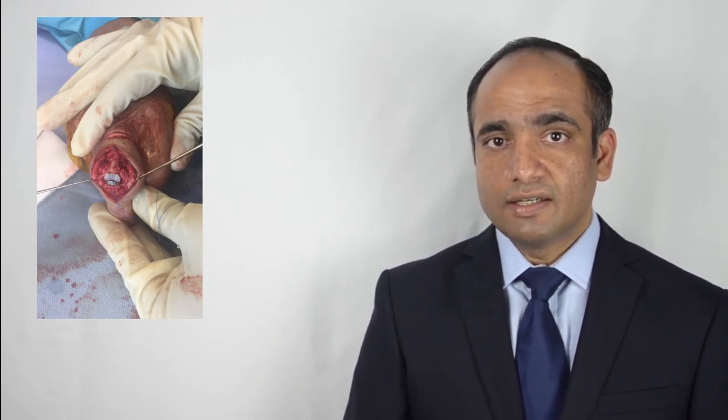This video shows the intraoperative footage where the arthritic joint is replaced with an artificial joint. This is exactly similar to a hip or a knee replacement, where part of the joint is replaced with a metal component and the other half by a plastic component. This is the post-op radiograph at the final follow-up, which shows good alignment of the artificial joint and integration of the prosthesis to the bone.